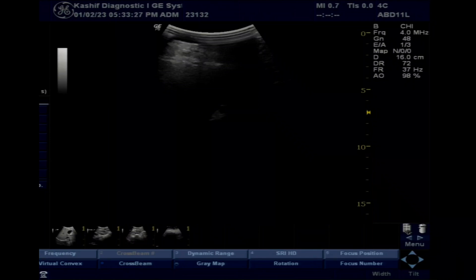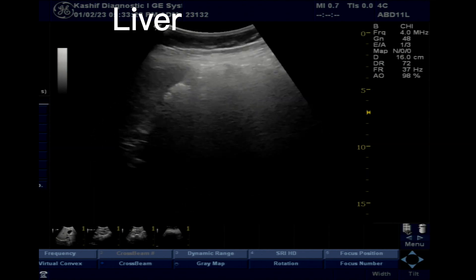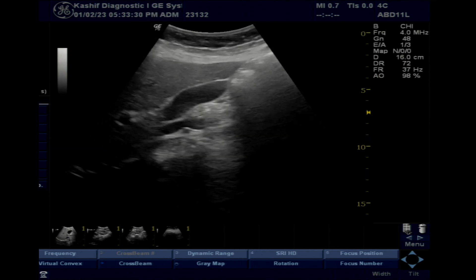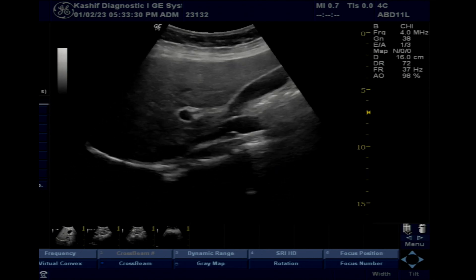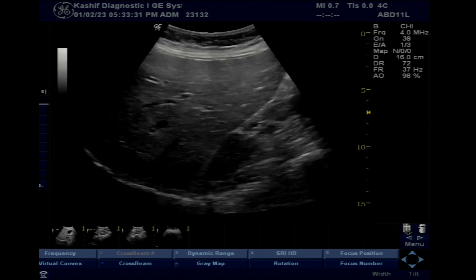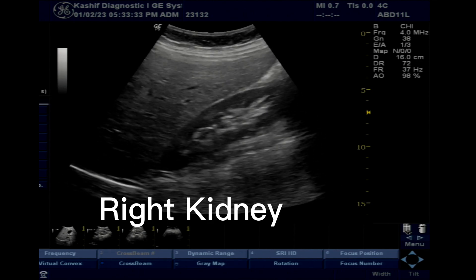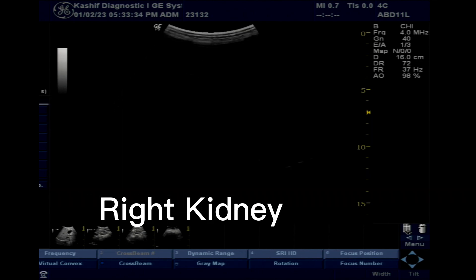This is a female patient, 32 years of age, with a history of C-section surgery 2 months back, now presenting with UTI.